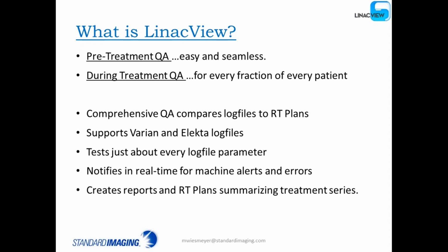Oftentimes we know that happens in our clinics, and we go to our physician and say, hey, what do you think about this? And the decisions are often made with little or no actual objective evidence. In this case, you can take your RT plan that summarizes your treatment up to date and put it back in your treatment planning system and see how that affects your doses. So it's a really useful tool.